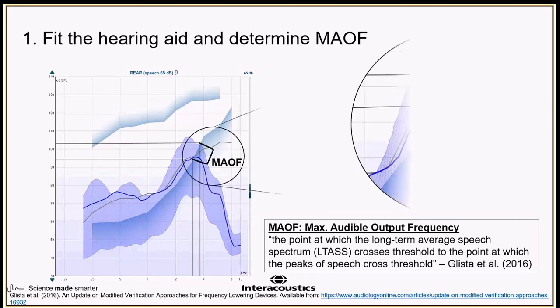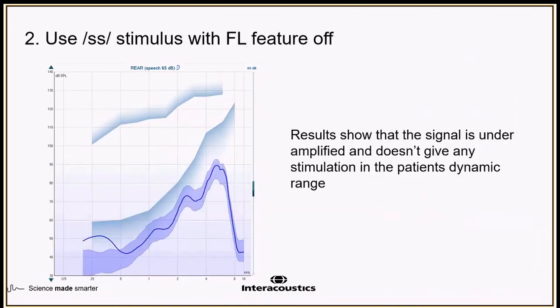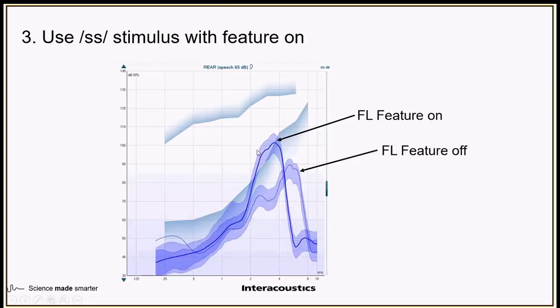Moving on from that, it's nice to show, as I've shown on this second screen, that the signal alone with the hearing aid optimized to their preferences cannot amplify into that area. Therefore, by placing this signal in this area, yes, it will be distorted. Yes, it will sound different or strange to them, but it gives them access to something that they would otherwise not have any access to at all. And it's completely an adaptation thing. It may even be useful to apply two programs to that hearing aid, where we have it on and off, and allow them to try and adapt and use that in different environments to see what benefits it brings. Excellent point, as always, Dennis.